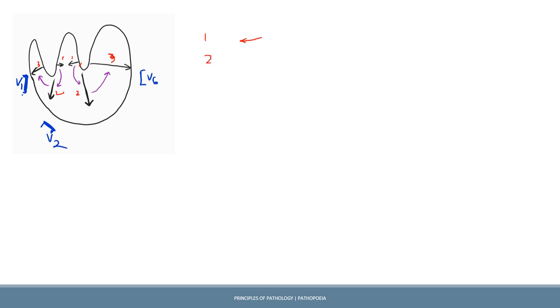Now in the second one the resultant is downwards only, and in the third one the resultant is towards the right side, not this much big. The resultant cannot be bigger than the original vectors, but just for the sake of showing the direction, right? So towards the right. Now let us plot the ECG in V1.